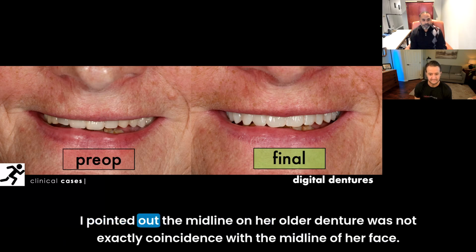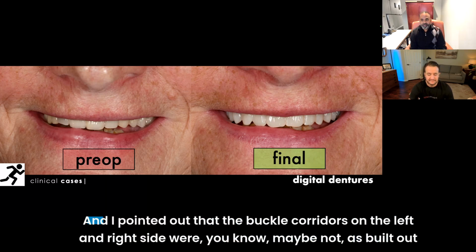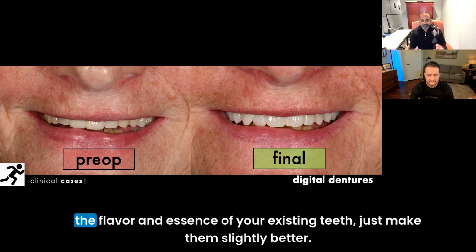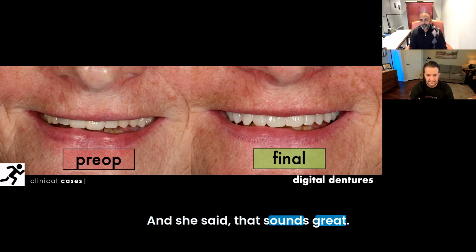Like I pointed out, the midline on her older denture was not exactly coincident with the midline of her face. And I pointed out that the buccal corridors on the left and right side were maybe not as built out as they could be. And we pointed out the wear on the teeth. I said, well, what if I could give you the flavor and essence of your existing teeth, but just make them slightly better? And she said, that sounds great.